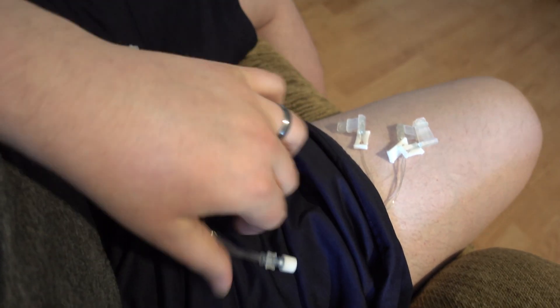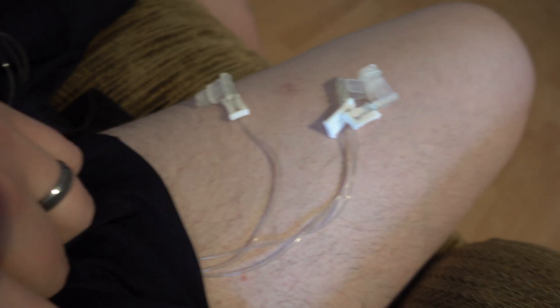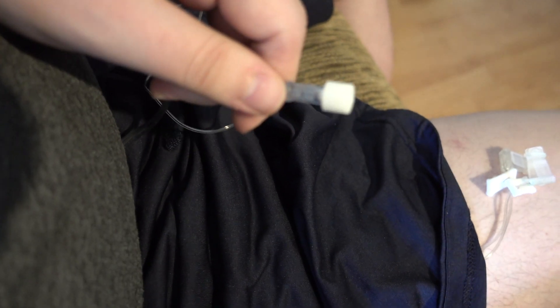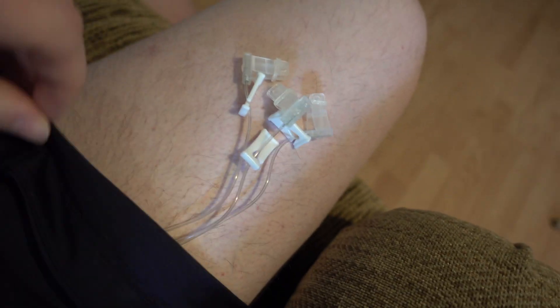I've got my shorts prepped where I've run three of the injections through my shorts and underwear so that if I have to go to the bathroom it makes it easy to pull those off. The other three are going to go in my stomach, so I'm doing three in my stomach and three in my leg today. Here is the connection that hooks up to the flow rate tubing and then into the pump.